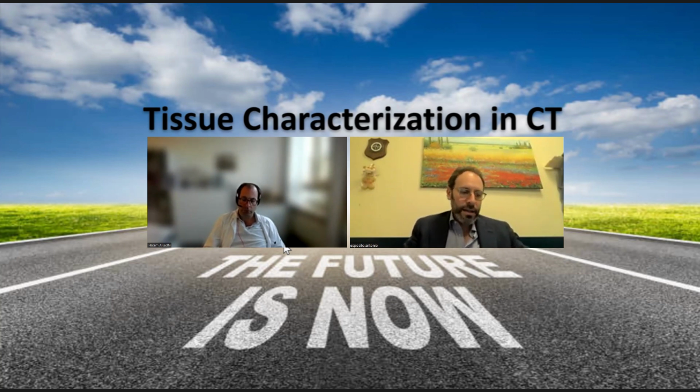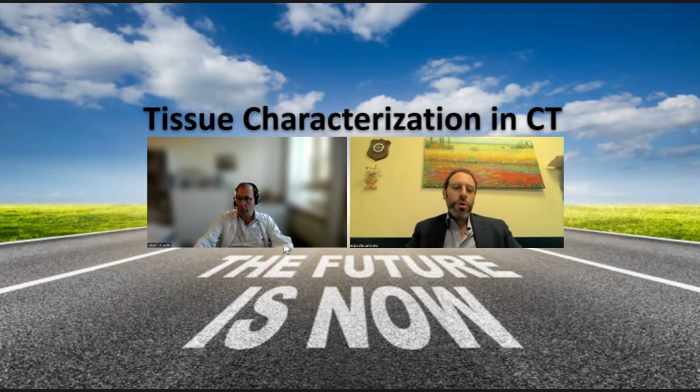Another point that we can highlight is that probably it is useful to stay shorter in patients with non-ischemic cardiomyopathies. So usually I stay up to 6-7 minutes in patients, for example, with myocarditis, with hypertrophic cardiomyopathy, with amyloidosis, and so on, and to use a longer timing, 10-12 minutes, in patients with ischemic cardiomyopathies, because in this way you have a reduction of the attenuation of the blood pool. And so for the subendocardial scar, it is better.